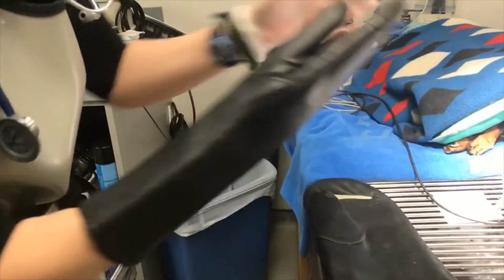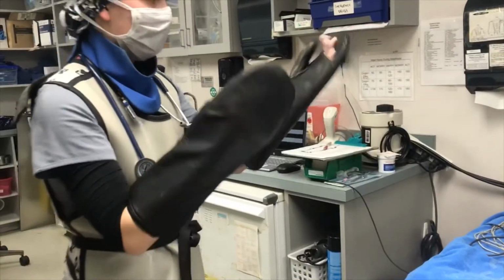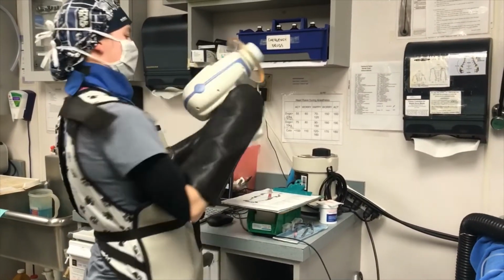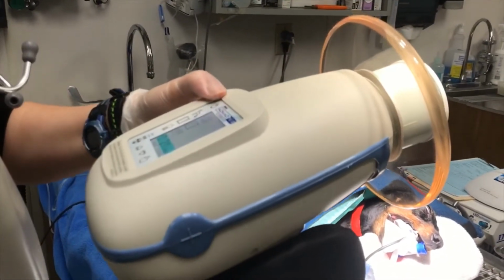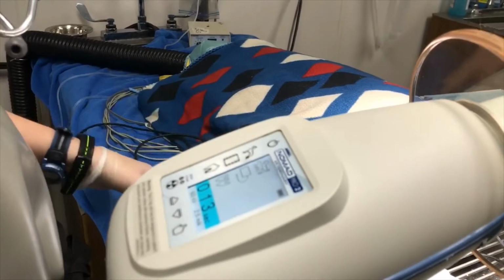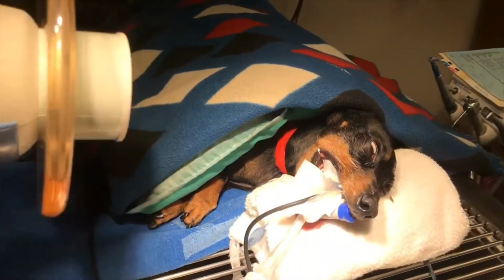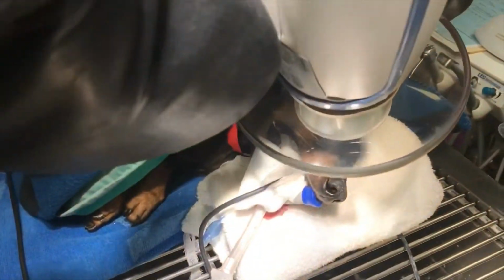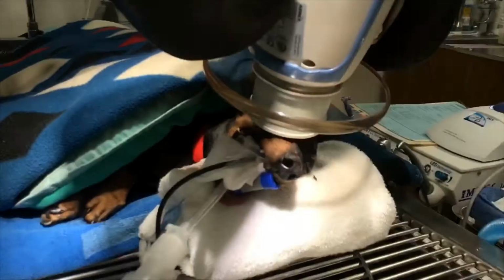Our machine is a handheld unit, and it does have a scatter shield on it, but just to be extra safe, I'm wearing our radiation gloves as well as our apron, just for extra personal protection. I'm going to make sure I have my proper settings for the teeth I am taking. That way we have the proper kVp and mAs. So for the bisecting angle, I'm going to come pretty much straight down, shooting wherever it is through the eye.